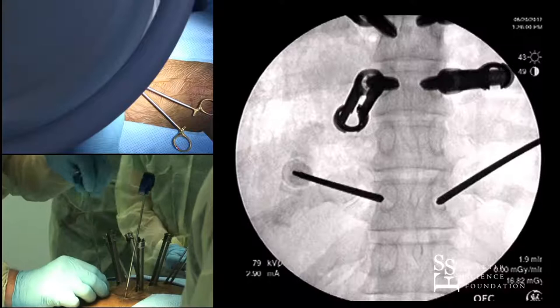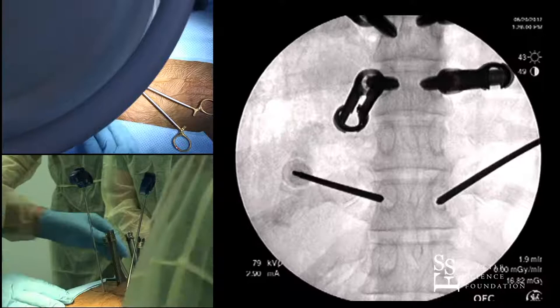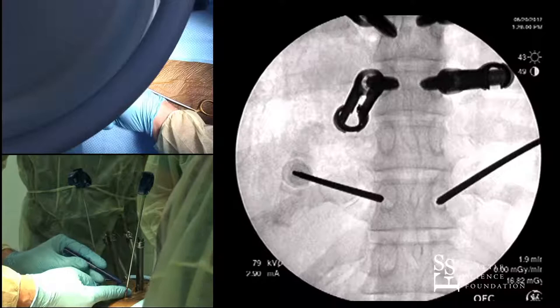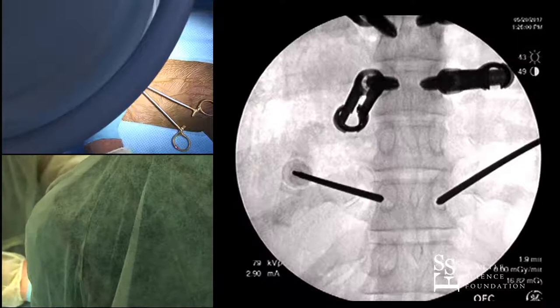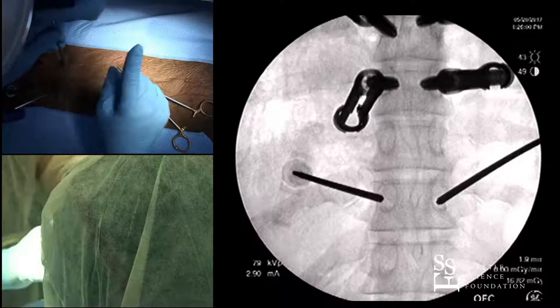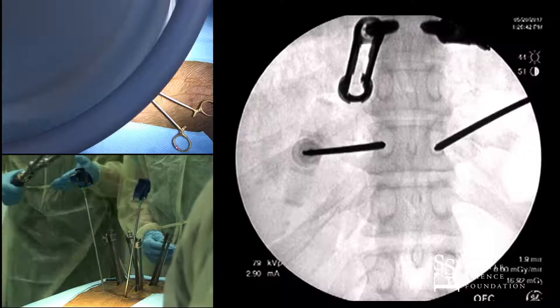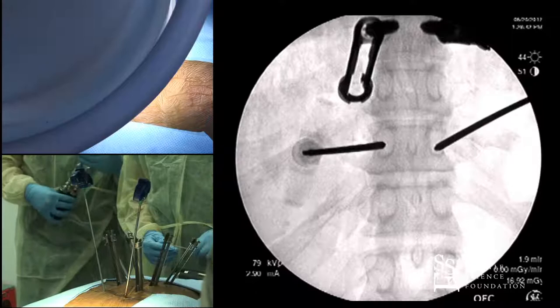We'll tap them in and get them just so they'll stay in the bone. A lot of times you can feel it drop into the pedicle. So if you see here, we've got two started — mine might be heading a little more medial, but when I've got it just into the bone I can make adjustments. I'll work off the AP most of the time. I'll use my finger to mark about a centimeter for it to go in, then tap it in about halfway to my mark.